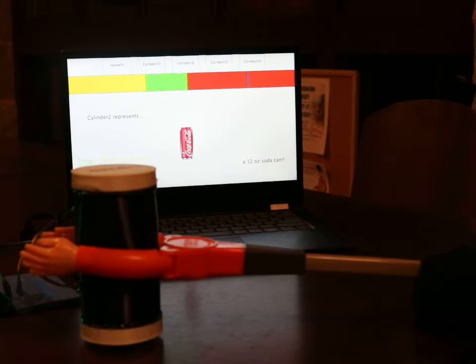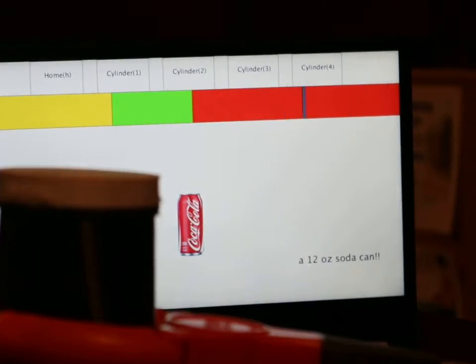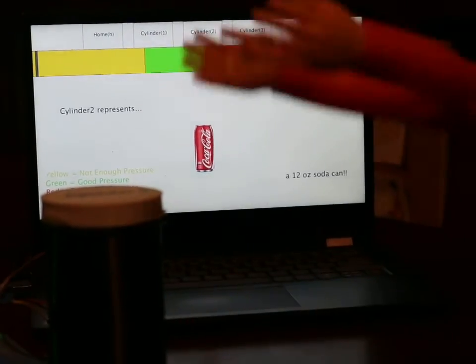In some cases, when you grip the items, you might be gripping too much, and the program will let you know that you're gripping too much. In this case, all you would have to do is adjust your grip using your prosthetic to the green area, and then when you feel comfortable, you could then release it.